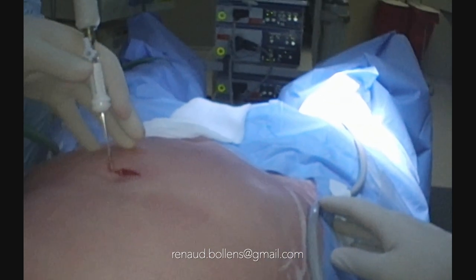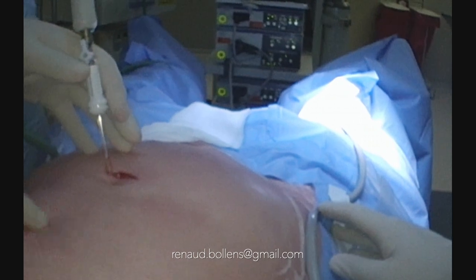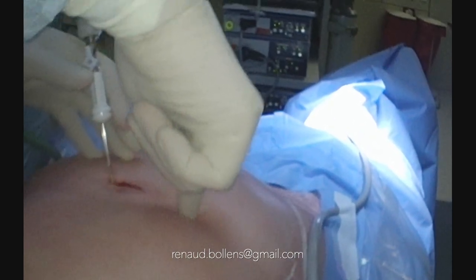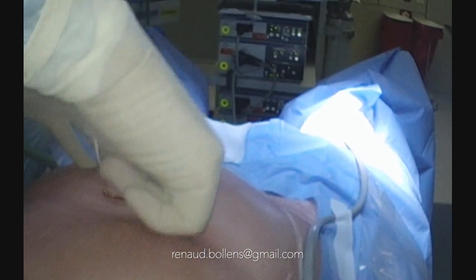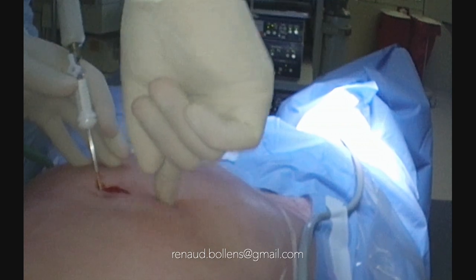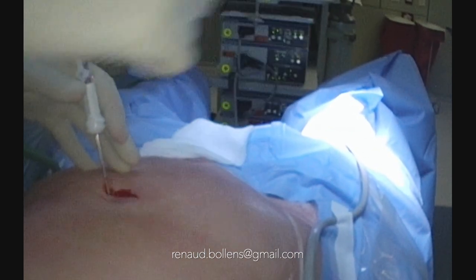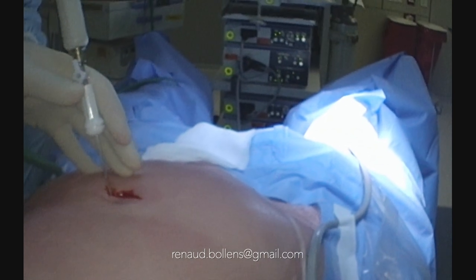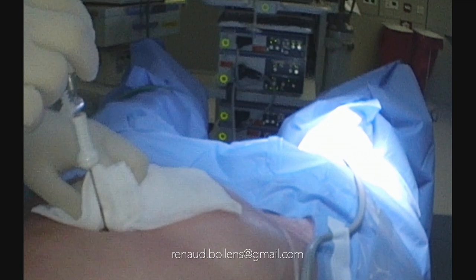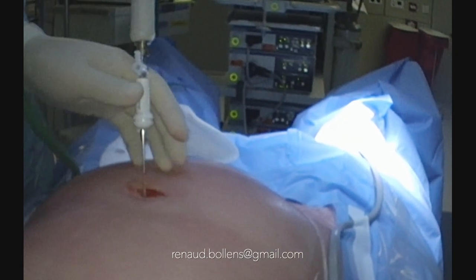Now we wait to have enough pressure because if we put the first port without good pressure inside the abdominal cavity, the abdominal resistance is not strong enough to avoid that the wall goes down. And if the pressure is not enough, the abdomen goes down. And when I pass inside with my port, I can touch the bowel behind. Then the rule is normally to have at least 10 millimeters of stable pressure before trying to put the first port.